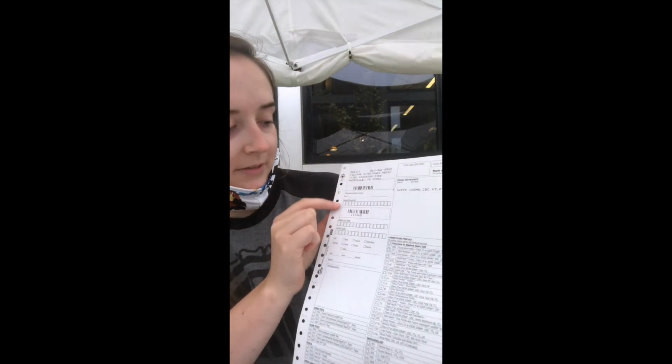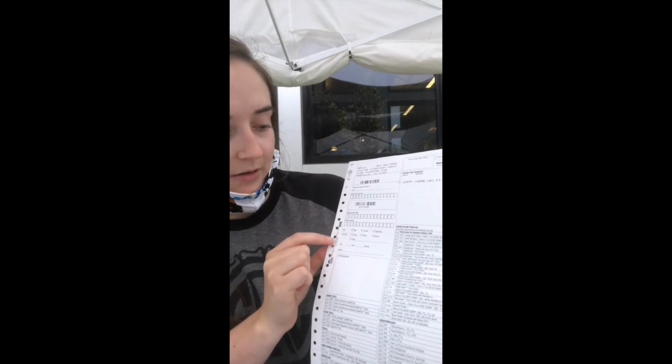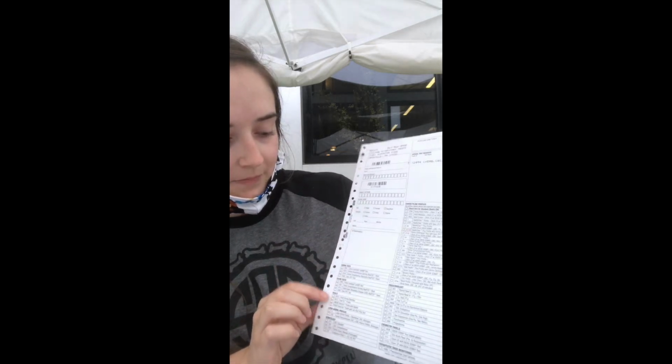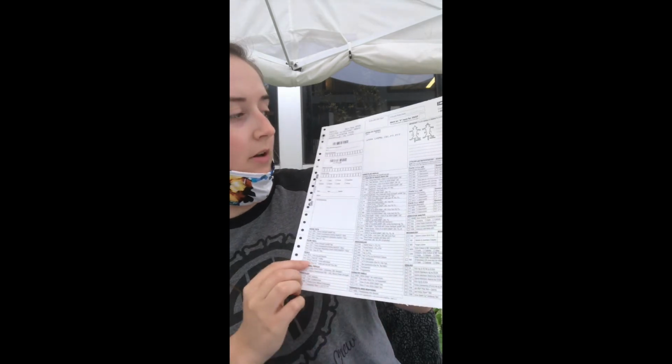We usually print out forms from our AVMA system, but this is a handwritten form that we could send to IDEXX if our computer system was down or in any kind of weird case like that. So this has our information, our clinic's information, the patient's information, the owner's information, the signalment, and then all of the tests that IDEXX has to offer. And then we would send one copy with the sample, and then we would keep a copy for our records.